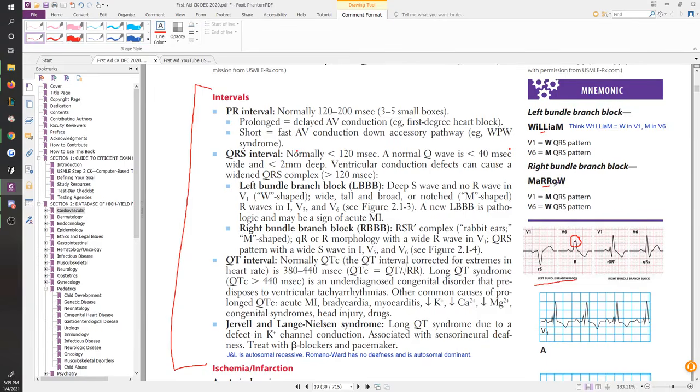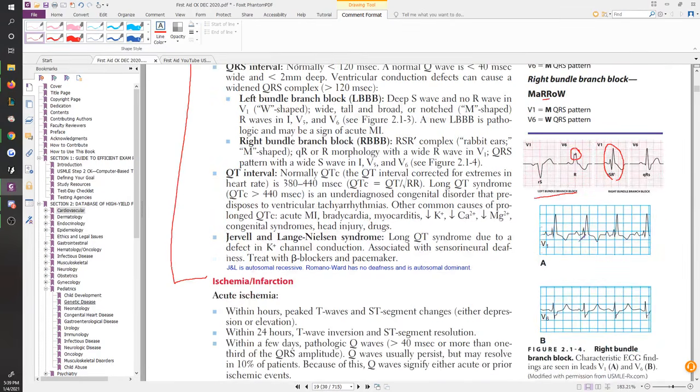So this one is supposed to have an M on V1, and again, you could very nicely see that, right? You could nicely capture that M in V1. These two M's look very different from each other. Right, so you can see how the V6 version of the M is actually a tiny M on the top. The V1 version of an M makes the entire QRS into an M. Okay, so they look very different from each other, but nonetheless, they both look like an M. Very, very nice and easy to catch that, right?